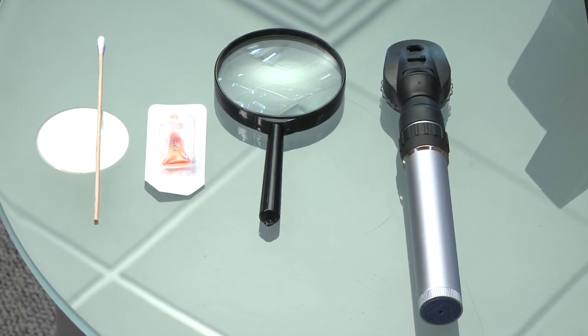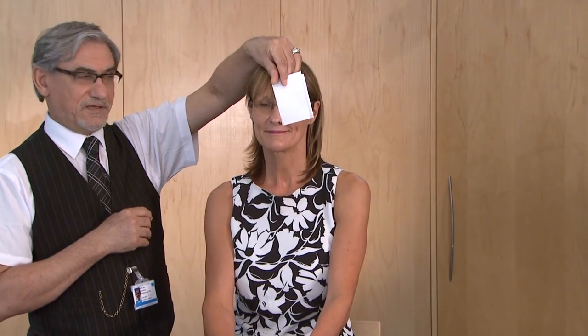To check vision, we traditionally check the right eye first. We cover the left eye and ask the patient to read the chart. So here we go, Julie — the bottom line. She reads: T, A, X, U, V, O, A — can't read that. Excellent — so that's actually 6/6 vision. And again the bottom line: H, V, O, A — excellent. So that's roughly 6/6 to 6/5, which gives you a clue that this is very good vision.